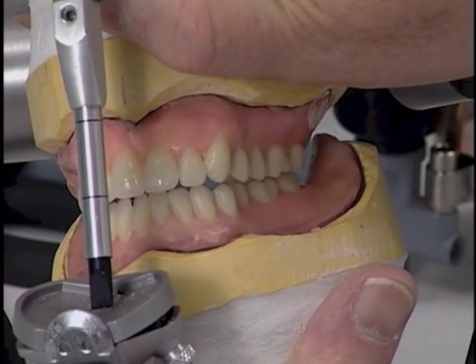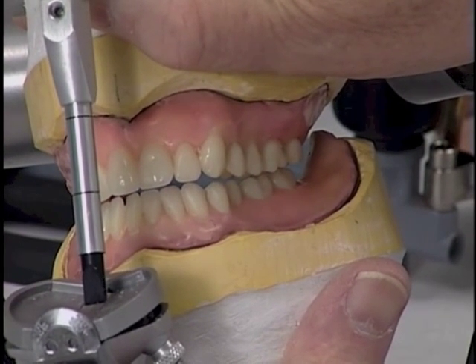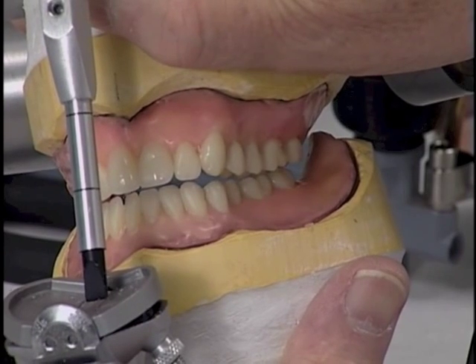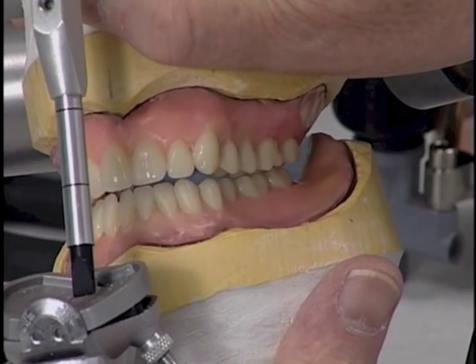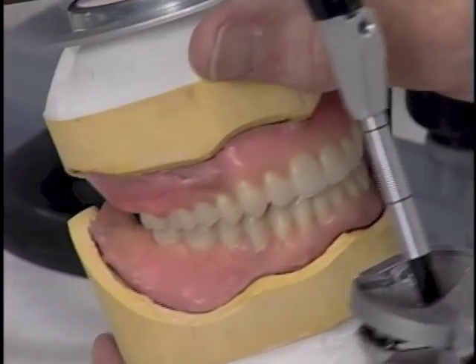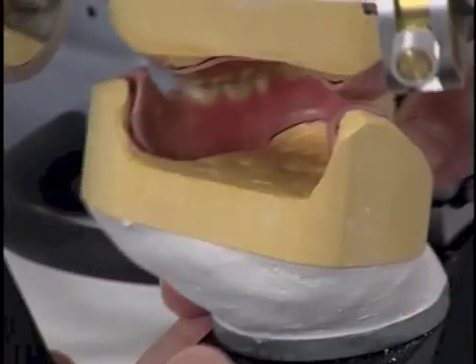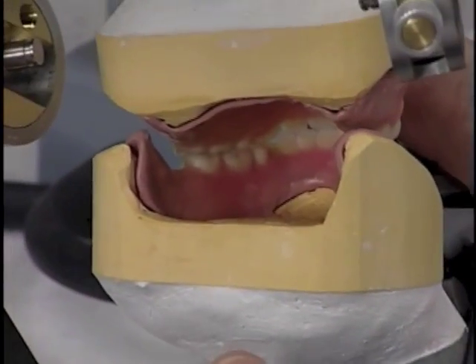When we move it into right working relation, we'll see that on the opposing side the lingual cusp of the maxillary contacts the buccal cusp of the lower, thus giving you balanced occlusion, bilateral balance. If we turn it around and look at the linguals now, we should see the same things occurring.